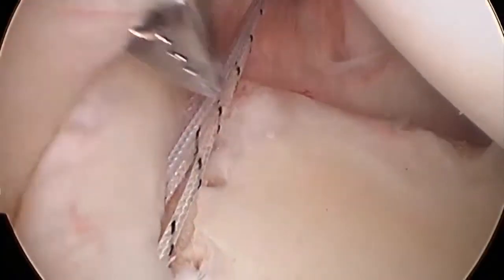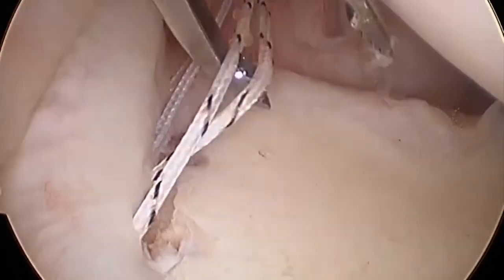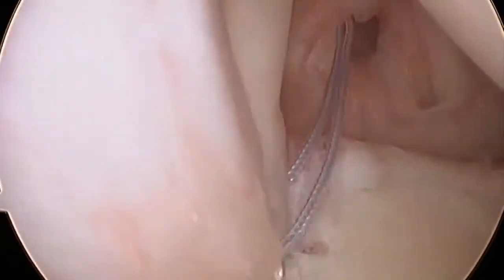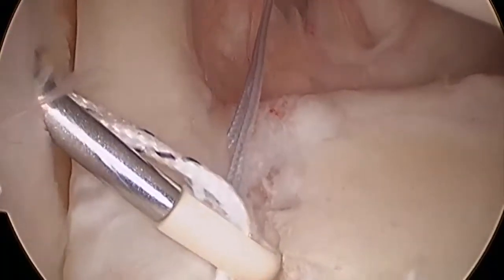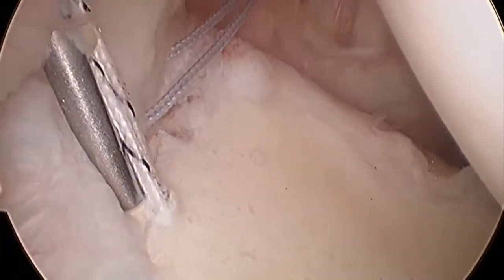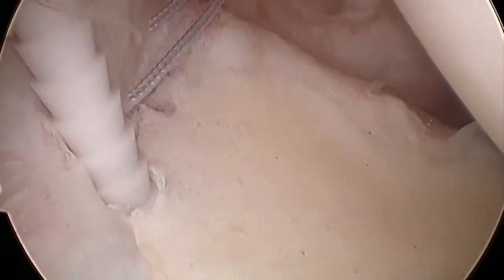The posterior suture limbs are withdrawn together via this portal. The sutures are then loaded into a 2.9mm biocomposite push lock anchor, which can then be railroaded down the sutures to be driven home into the posterior pilot hole.